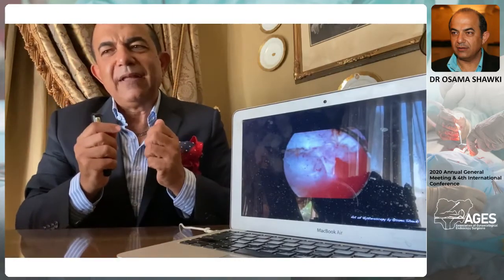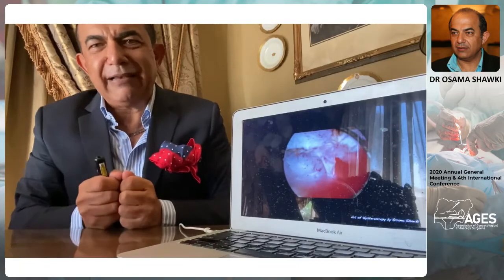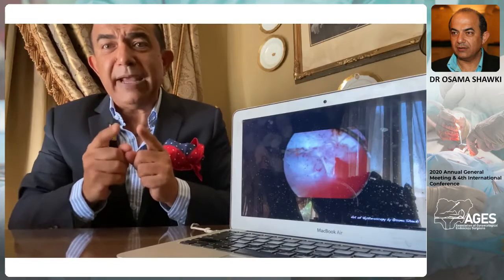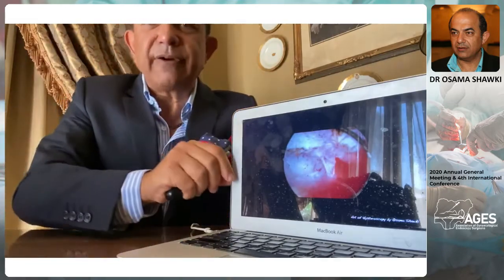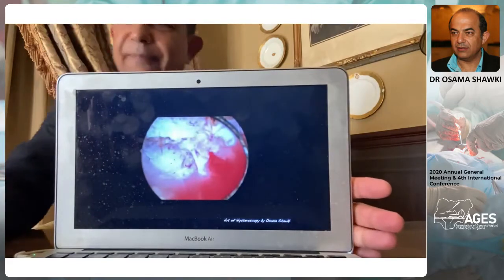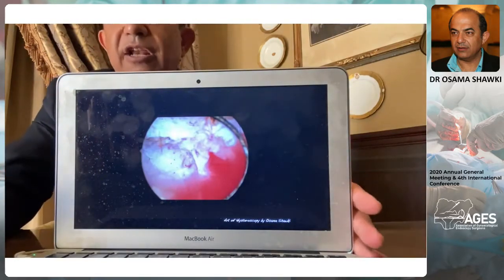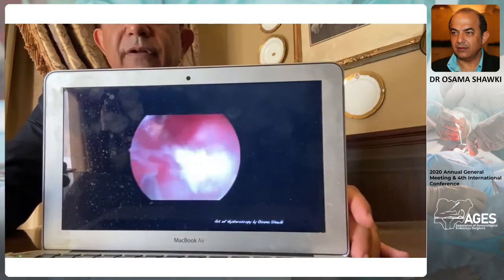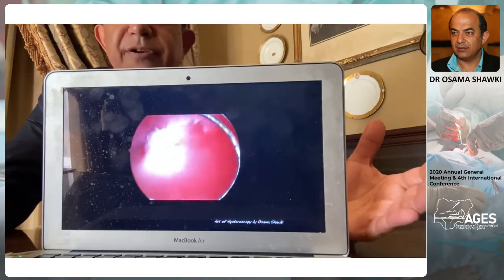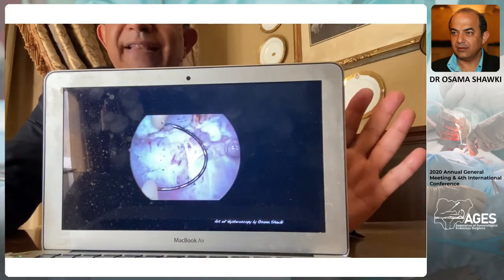Please, we have to be scientific. We have to obey the guidelines, but we have to be logical. The guidelines are not made to delete my mind, all right? So with all my respect to those who put a guideline that don't exceed a pressure of 80 or whatever, this is not accepted in a situation like this. Look, now you cannot see well. So when we increase the pressure, now the pressure increases, you can see well now, and you can touch the bleeder.